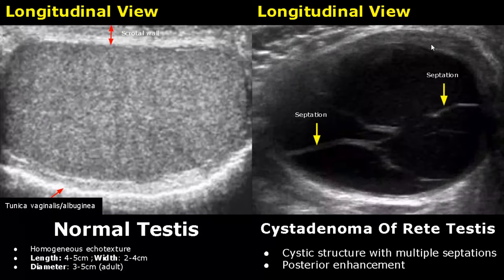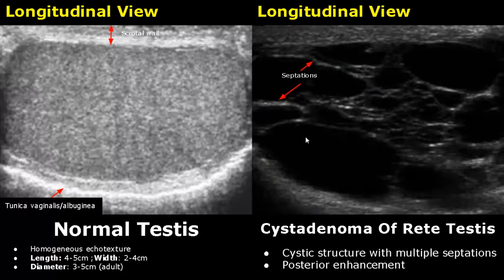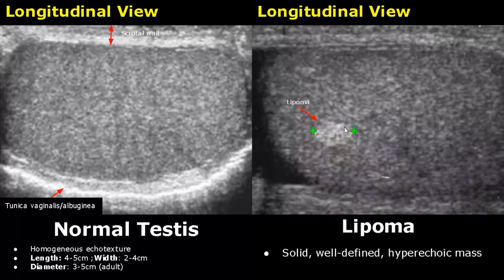Cystadenoma of the rete testis is a rare tumor. The cystic structure will contain multiple septations followed by posterior acoustic enhancement. Here is another image of cystadenoma of the rete testis — it is a cystic structure with multiple septations.